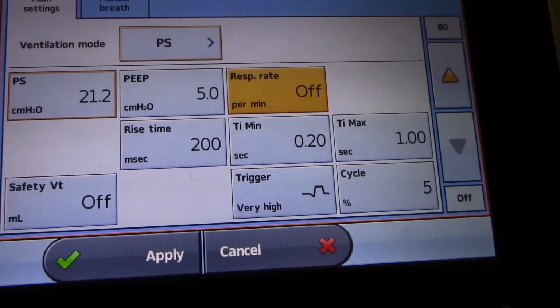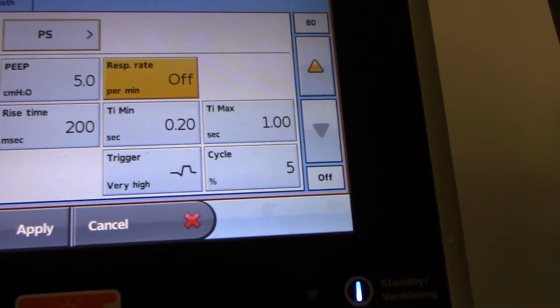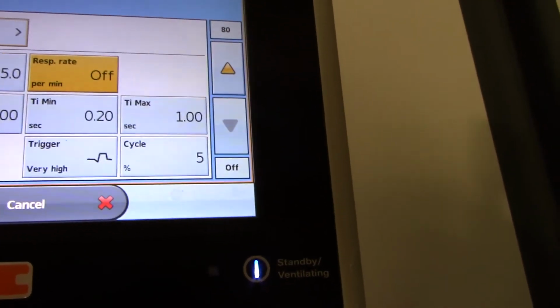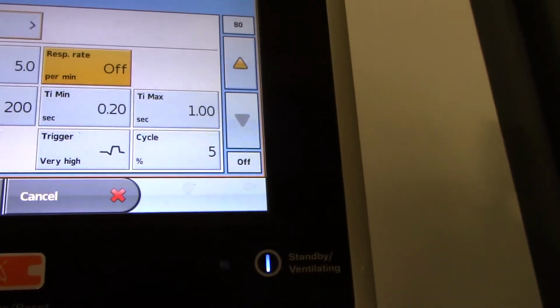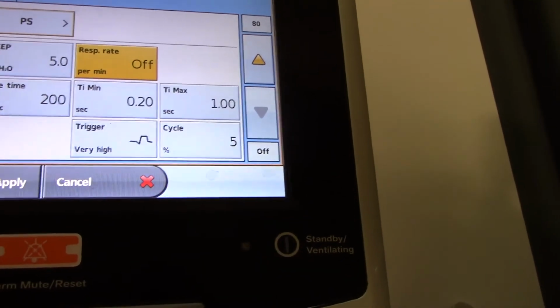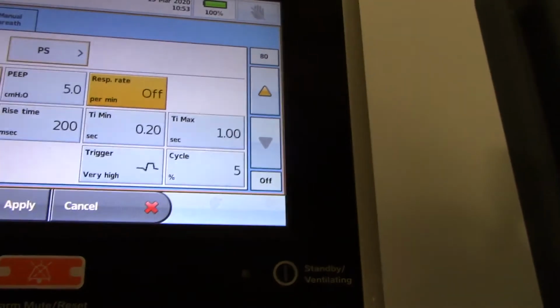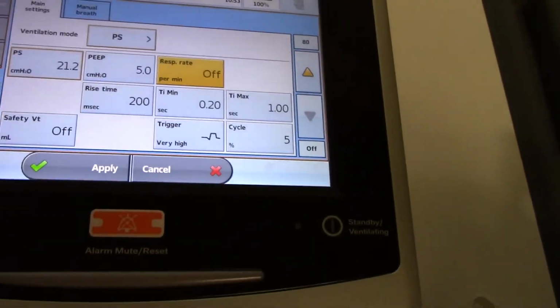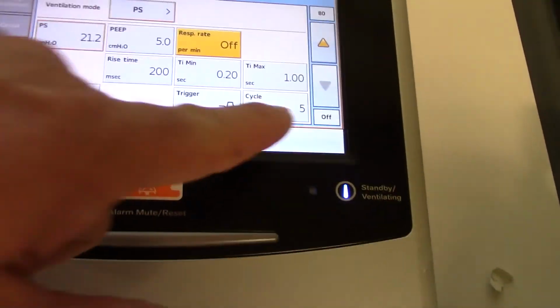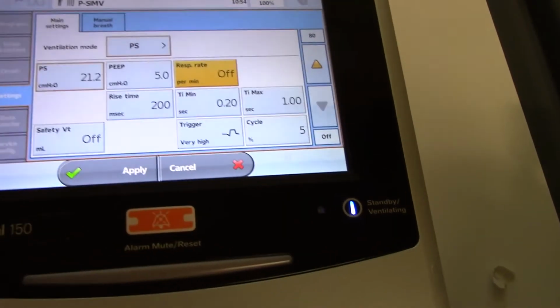And then your rise is applicable just before your minimum I time and your maximum I time. You're going to set your maximum I time to the highest I time for that patient, based on our I time policy, not because it should matter in this scenario, but to set it. And then your minimum, you'll probably set to the minimum I time based on our I time policy as well. And then your trigger and your percent cycle at 5%, as close to 1% as we can get it, equal to the servo.